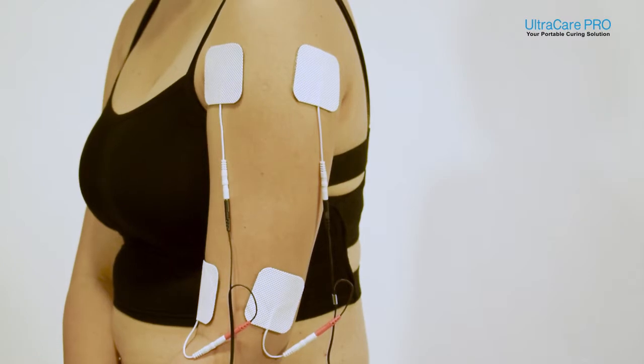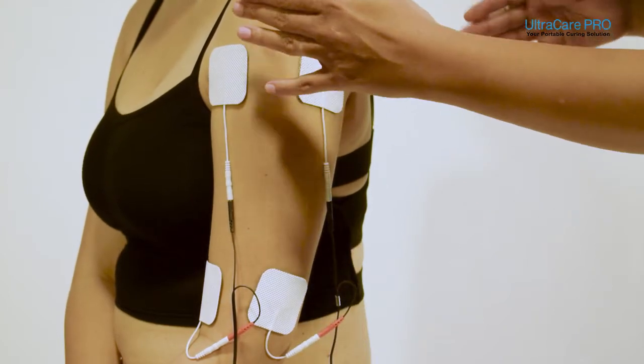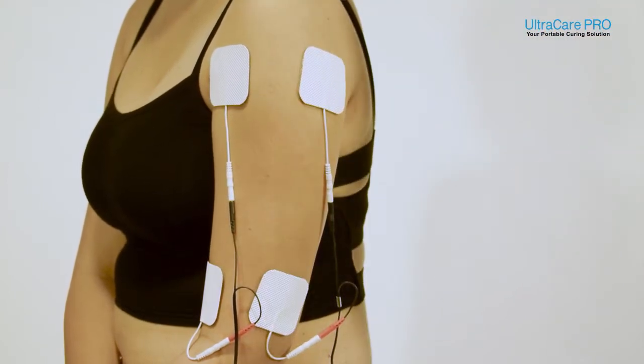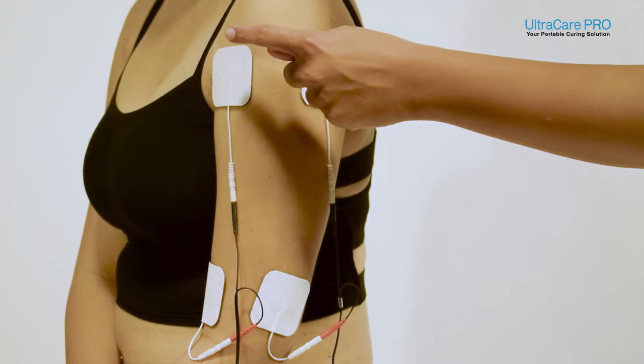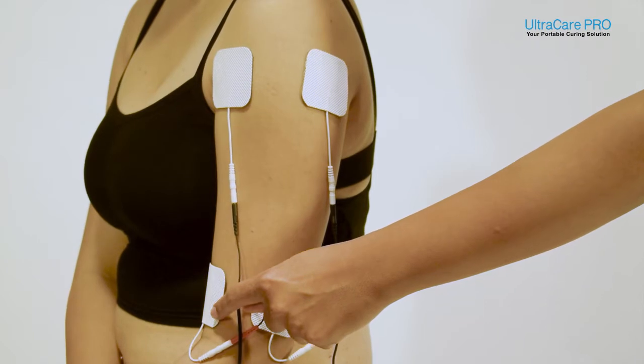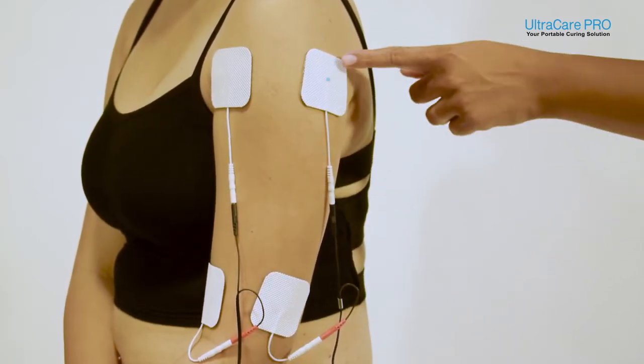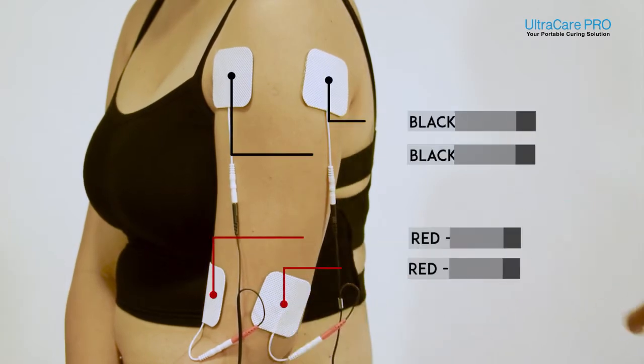As you can see here, I have placed four electrodes surrounding the arm region. The electrodes are placed such that they lie one below the other, which means the electrode from channel 1 is placed one on the upper end of the arm and another on the lower end. Similarly, the black electrode and the red electrode from channel 2 are placed one on the upper end of the arm and another on the lower end.